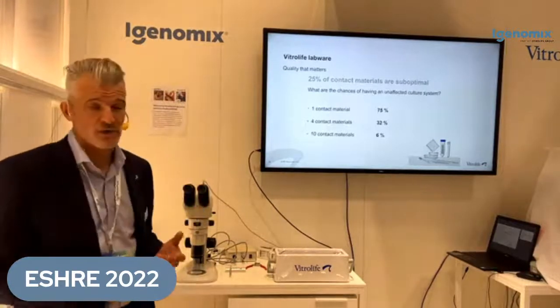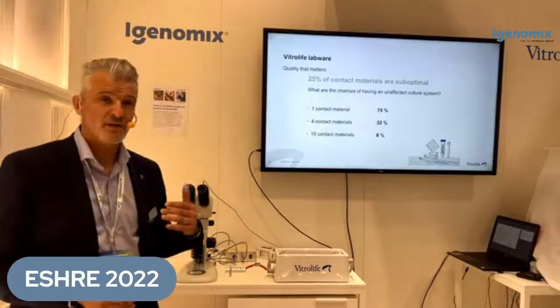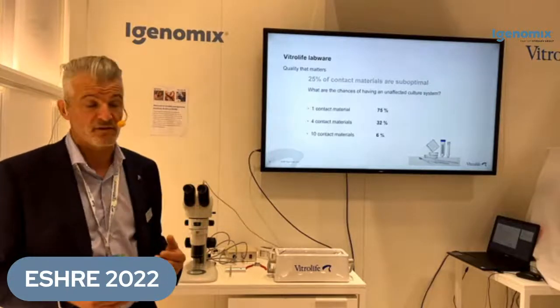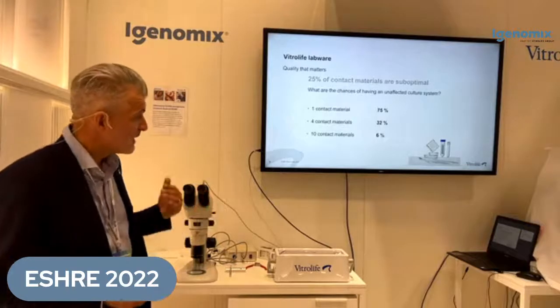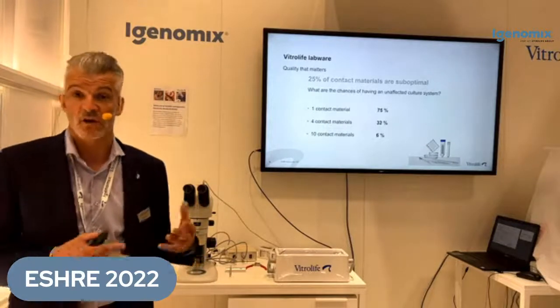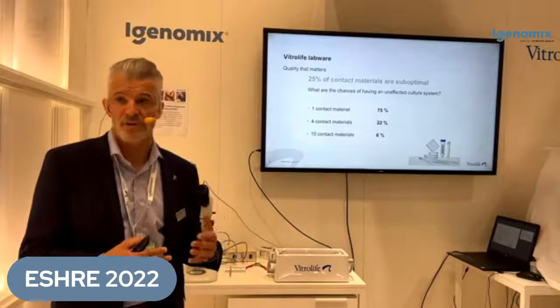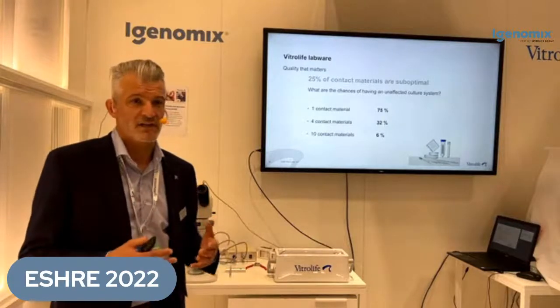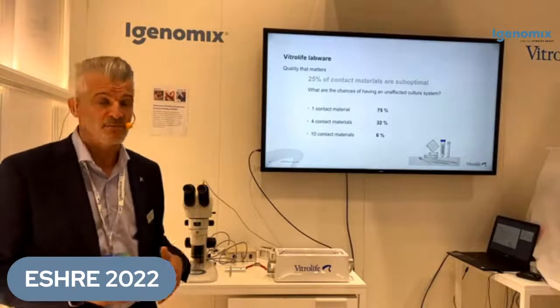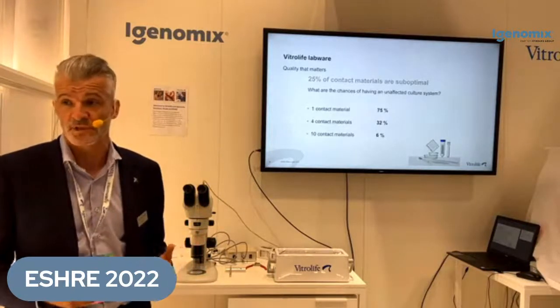Where we have one contact material, we have a 75% chance of having an unaffected culture system. As the number of these potentially toxic materials increases, we can see that the chances of your culture system being unaffected starts to decrease quite dramatically. And as we get up to large numbers such as 10 contact materials, we only have a 6% chance of our culture system being unaffected. Now, I think it's important to think about this, that when we talk about an effect on the culture system, this may not necessarily mean that the gametes and embryos degenerate, but rather that we see a subtle cumulative effect over time as we have an accumulation of toxicity in the system, which could affect fertilization rates and cause disturbances in embryo development.